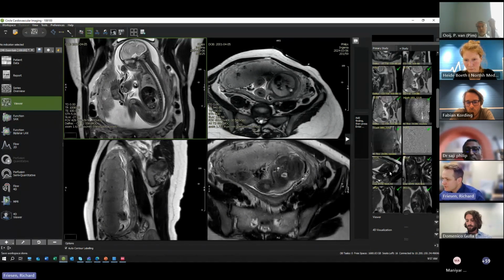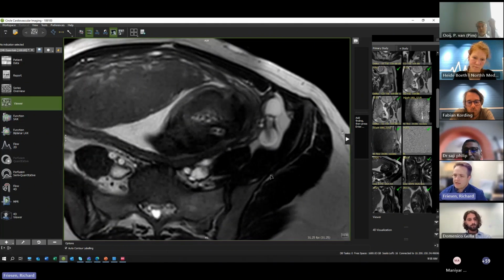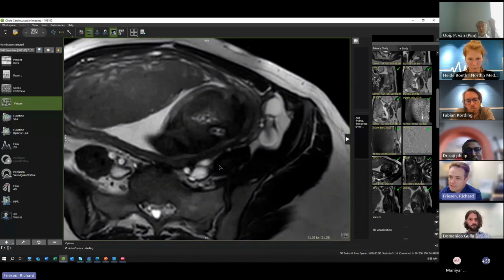And I will skip to the cine imaging so we can look at the 3D SVR shortly. So this is an axial stack that we start with. We use the localizers and often our 4D flow if we've acquired it beforehand, using that raw image to look at the flow data to adjust our planes and plan accordingly.